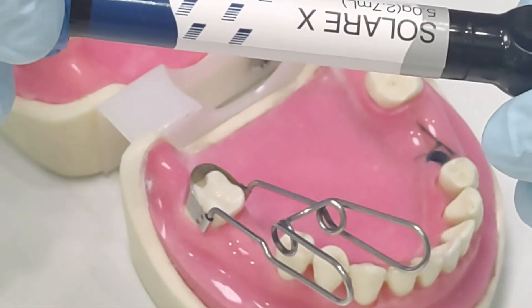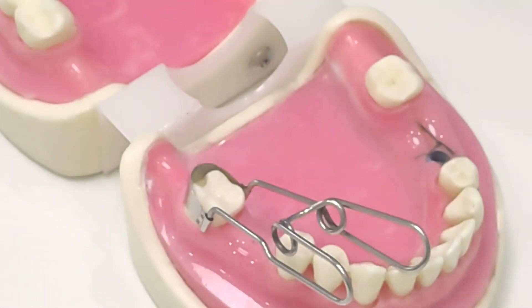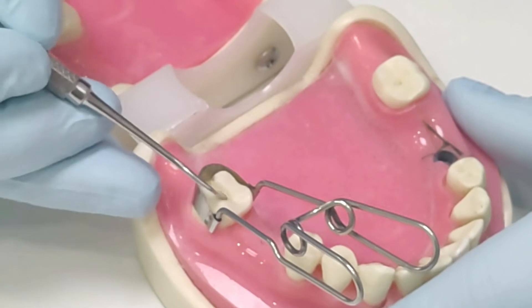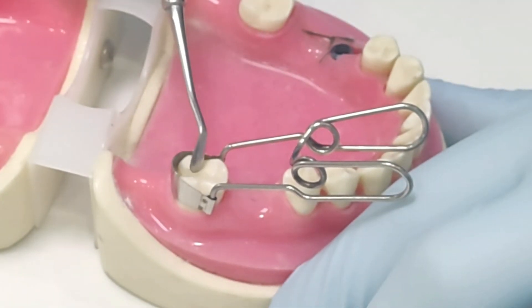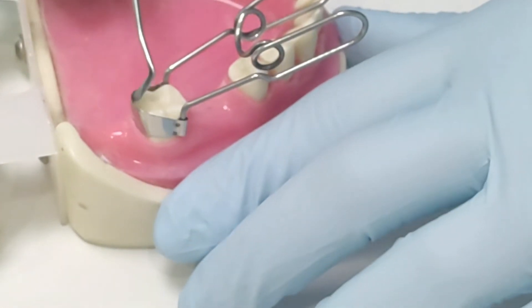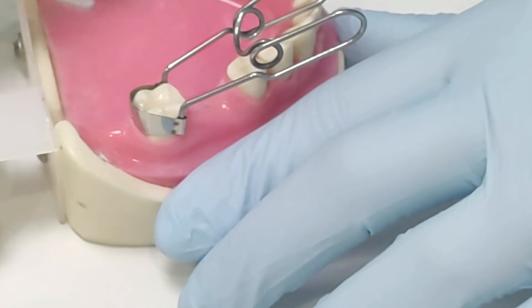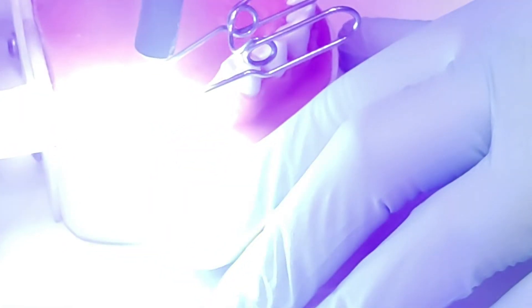Now I'm taking my conventional composite, Solare X — this is again by GC. A conventional composite is always required over EverX because the fibers reinforced into it are not very polishable. Since we are just doing this for demonstration purposes, I've not actually applied a rubber dam or shown the techniques for bonding. I personally prefer a selective etch technique.